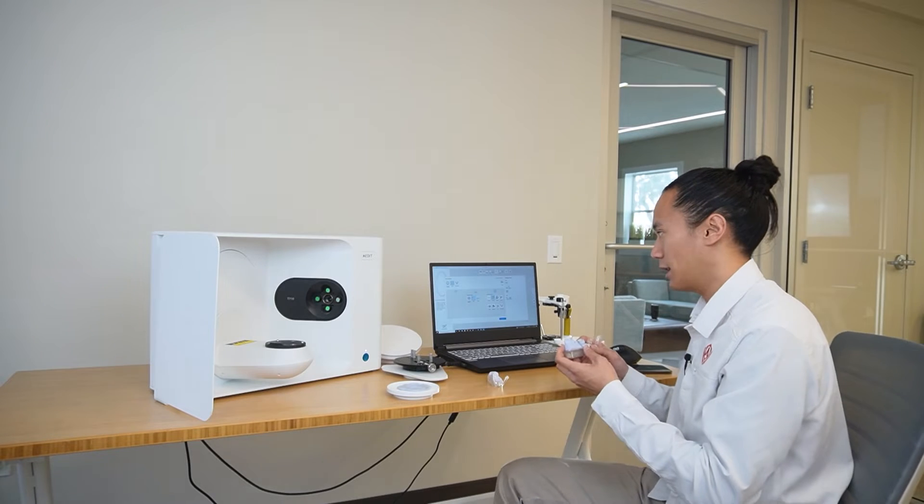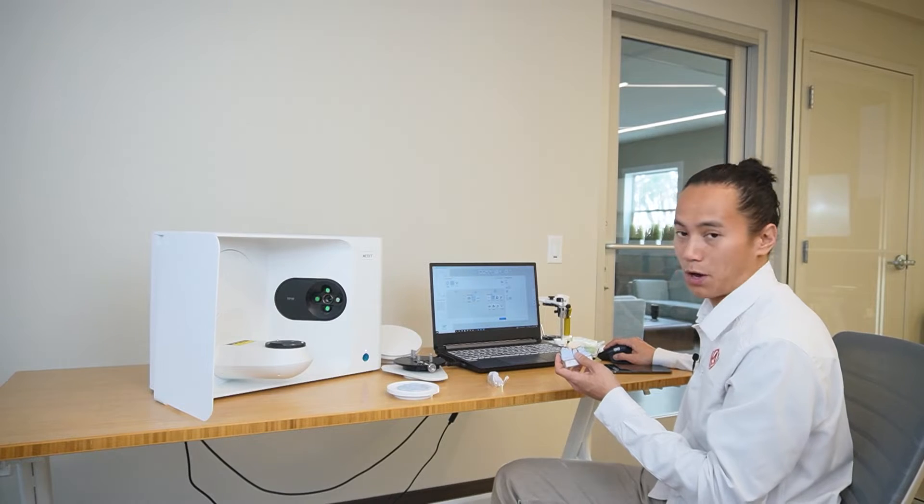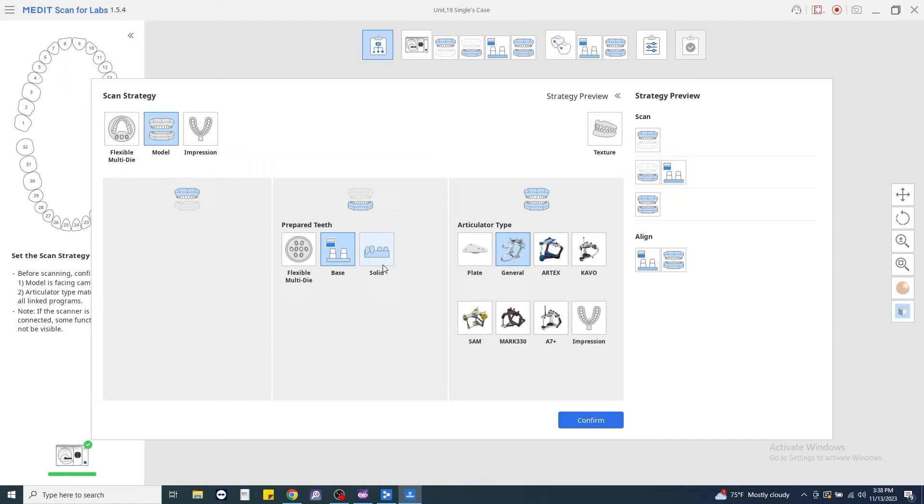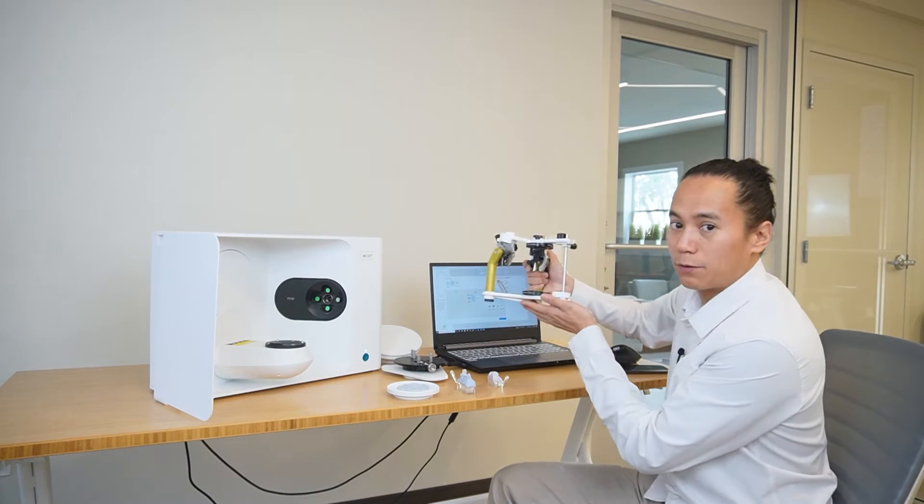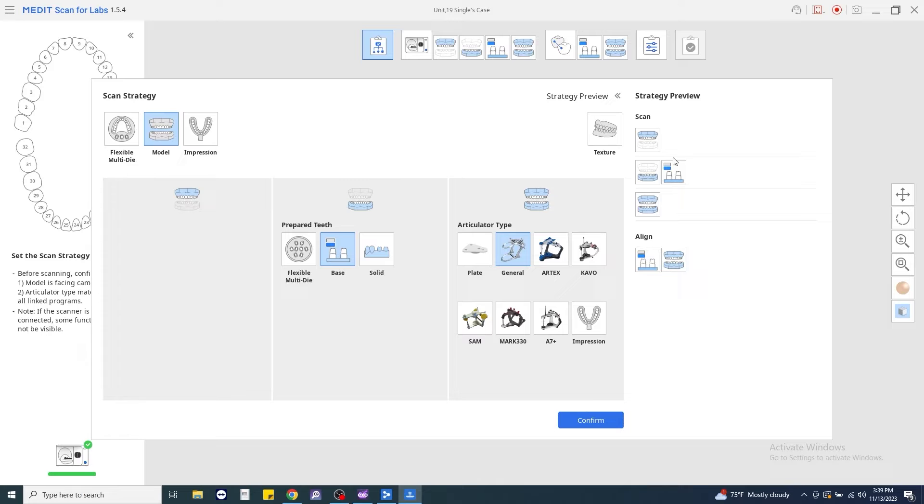If we had a solid task, a solid model, we would then choose a solid model. Under Articulator Type, we're just going to select General. We're going to go into the more complex full articulators later on. Once we have the strategy selected, we'll go ahead and click Confirm.